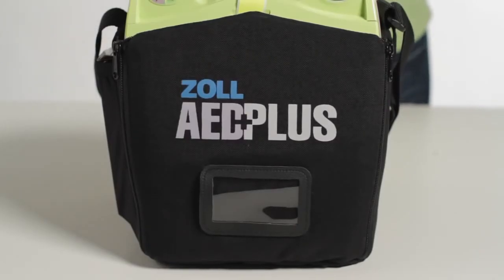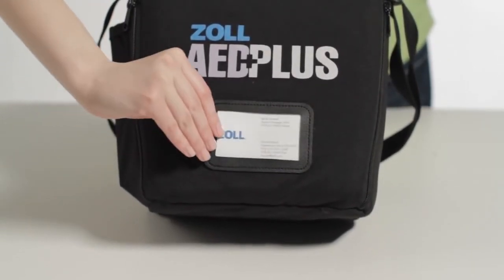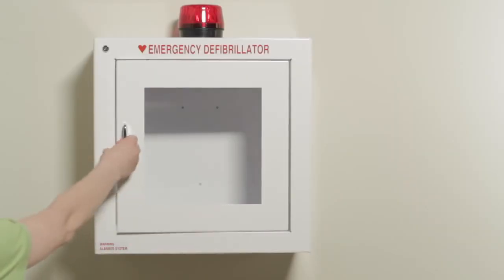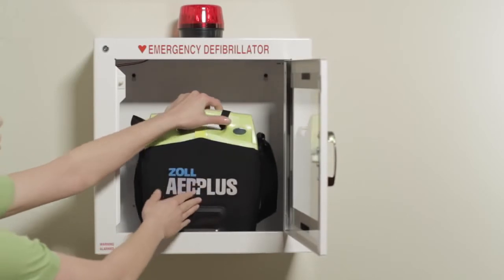Finally, there is a small pocket with a clear window in it on the front flap of the carry bag. It can hold a document the size of a business card. Once your AED Plus has been set up and tested, keep it in an obvious location that's easy to access.